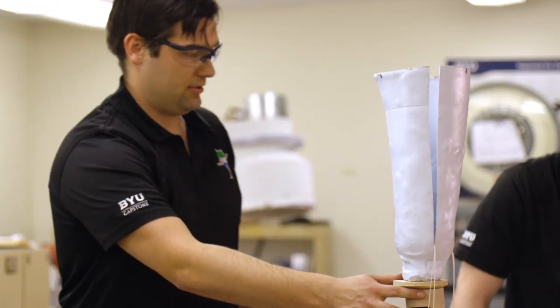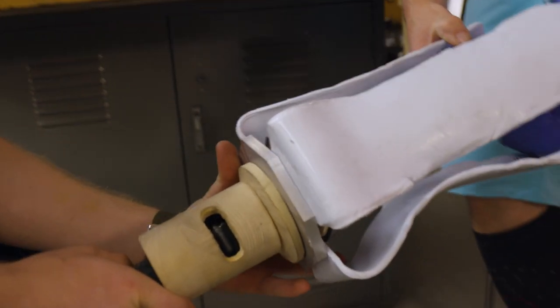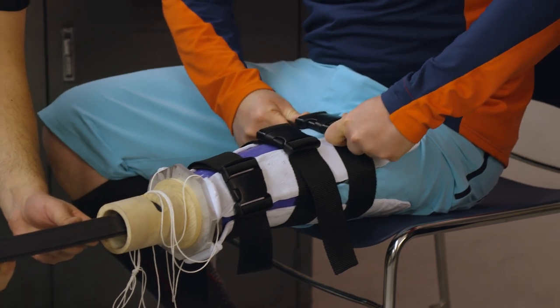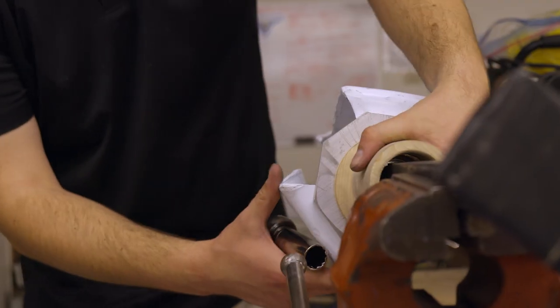Just like any type of shoe — you've got to get the right size shoe — an amputee needs the right size socket to fit onto their limb. This is a three-strut polypropylene socket. These struts are custom molded to the amputee's limb and then adjusted with straps attached onto the side. We developed this conical cup system that the Red Cross uses, and we've made sure that the interface between the socket works well.